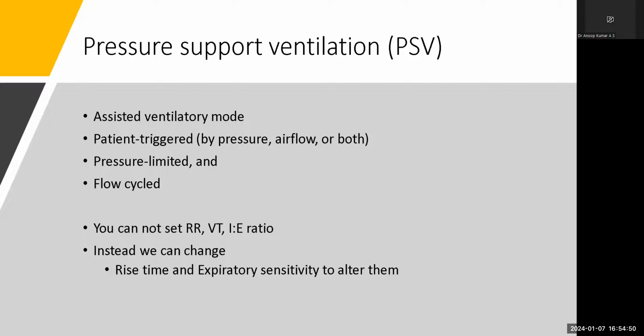So at the minimum inspiratory time, the inspiratory flow will be kept, and after the minimum value, the patient can go to the expiratory phase. And TI max means the maximum limit the patient can hold the inspiration, beyond which the patient cannot continue the inspiration, and it will be switched back to the expiration. So this is the pressure support ventilation.